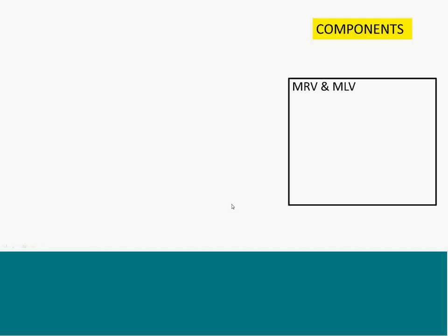The components which we see in a four-chamber view, most important is that you see the right ventricle and the left ventricle and confirm its morphology. You see the right ventricle is on the right side to the left ventricle. The ventricle should be reaching the apex. Very, very important understanding: the apex should be formed by the RV and the LV both. This gives you an understanding of the proportion of right and the left ventricles.